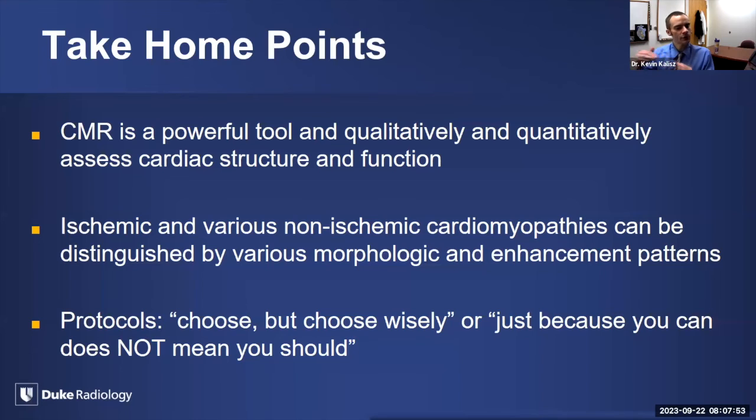And then I didn't focus too much on protocols, but at least mentioned different approaches and different protocols in terms of what's mandatory, what's nice but not necessarily mandatory, and what's certainly not going to provide you with information. I sometimes say, especially with cardiac MR, which these exams can get very lengthy, to choose and choose wisely. Or another way of saying that is just because you can do some of these sequences does not necessarily mean you should do all these sequences.